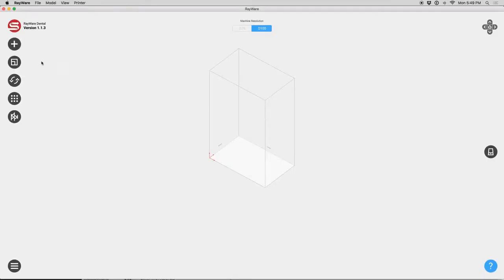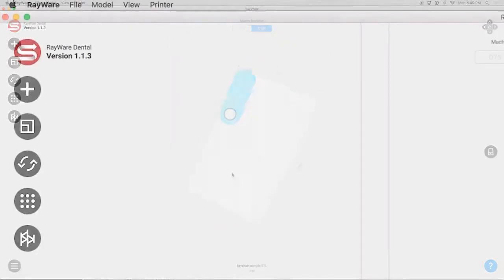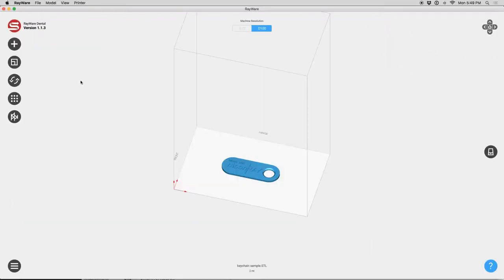To begin printing, first add your model by clicking the top icon on the left in Rayware. We recommend printing the Moonray test keychain first. Within Rayware, you can use your mouse or the buttons on the top right to change your viewing angle. The buttons on the left in Rayware give you several options to adjust your model before printing. The first option allows you to change size and scale.